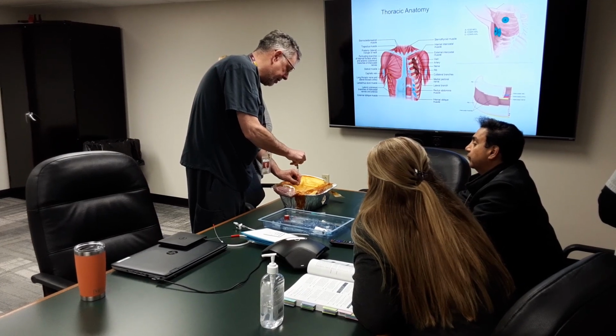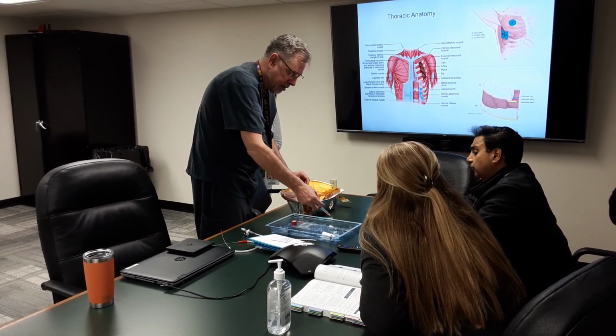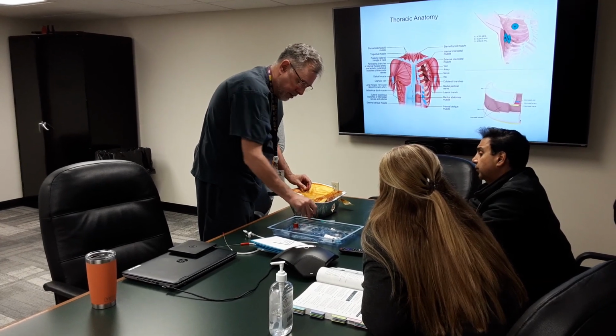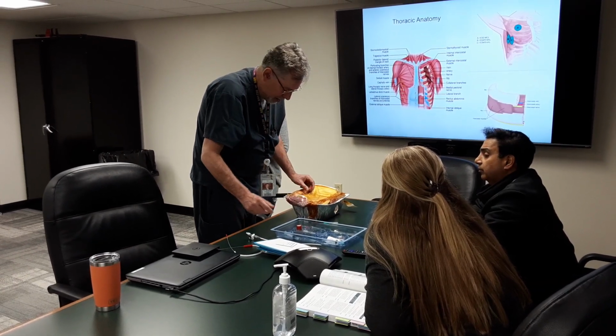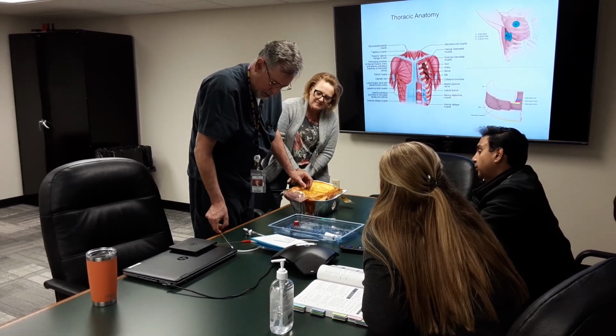Oh, wow. That's what I said. We're in. Coming from the OB nurses here. So, we're in, and now I'm gonna take the wire. So we'll hold the other.